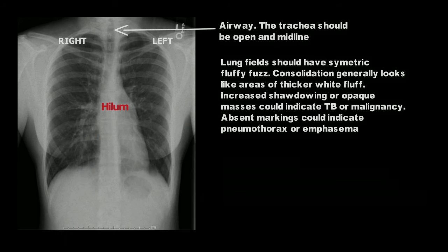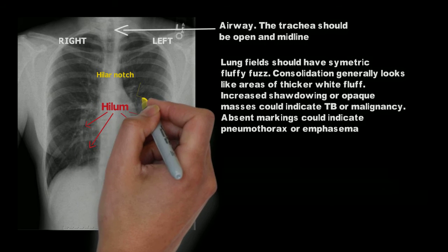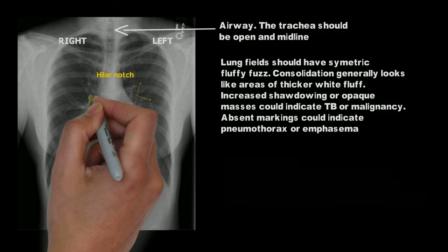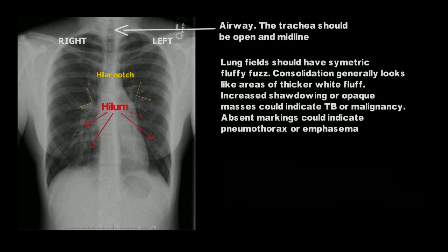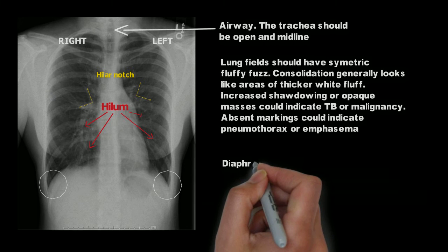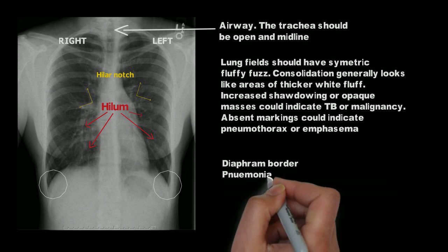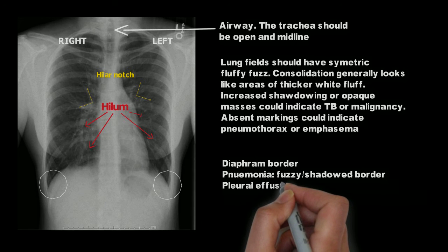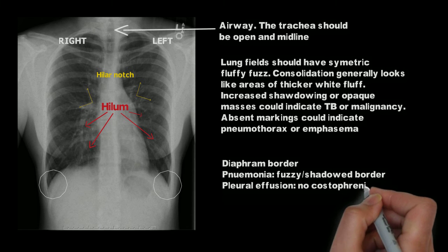Next, you'll look at the hilar structures. These are the vascular areas next to the cardiac silhouette and look more prominent because of the pulmonary blood vessels. You should see the hilar notch or hilar points on each side, usually higher in the left. Finally, down at the bottom of the lung fields, you'll see the sharply demarcated border of the diaphragm, which curves downward to make these angles called the costophrenic angles. If these aren't present, it most likely indicates a pleural effusion. If the diaphragm border isn't sharp and clear, this could indicate a lower lobe pneumonia.